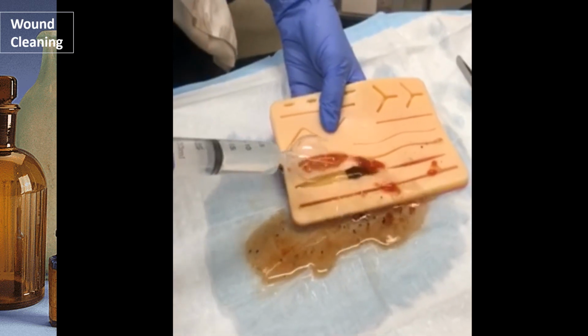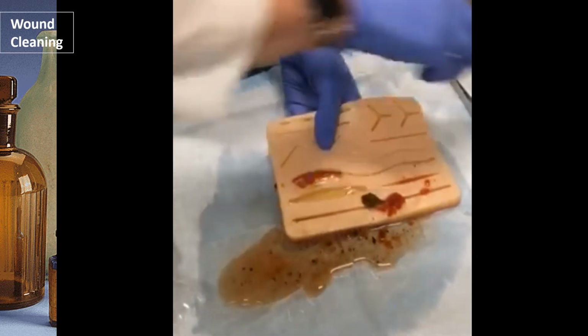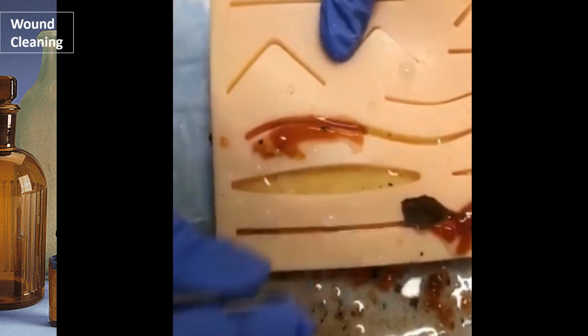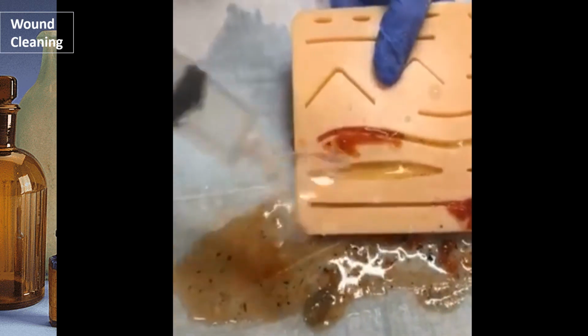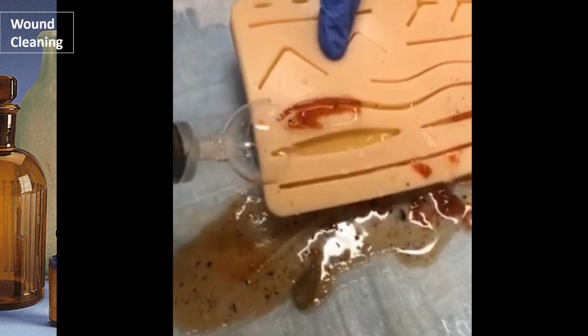And you're going to see all the debris. Look at there, even a leaf. Okay, if you can't get all the debris, use your utensils. Let's get it out of there. Any foreign body that we have is at risk for infection. So you see I'm removing these. Okay, I'm going to just get a little bit more water. Okay, so now we have a nice clean surface.